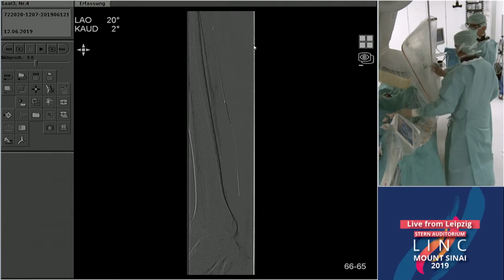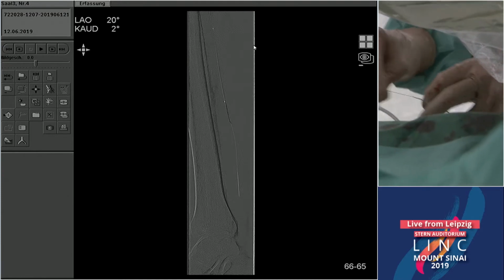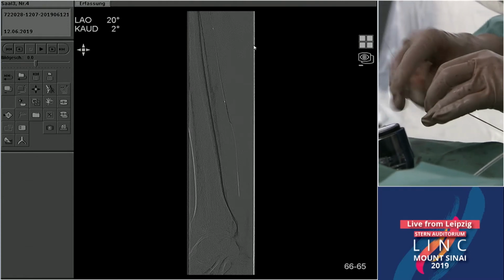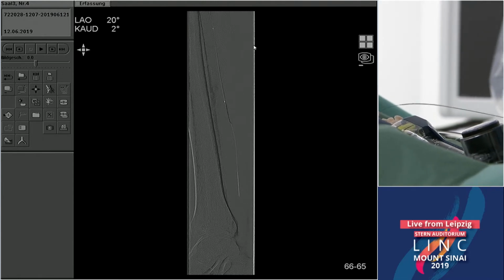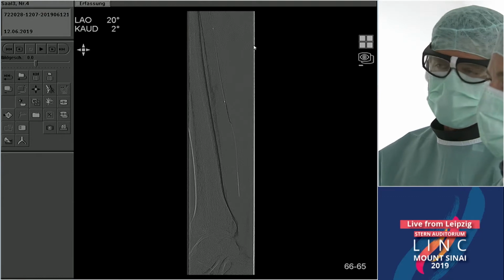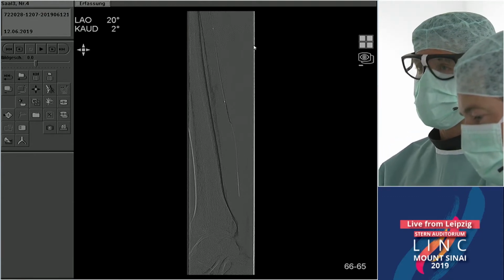Yeah. No, I think we'll find it back in here. I think the artery was open again. I mean, the problem here was just to find the entrance in the posterior. We'll not pull the wire out of the entrance now, but I pulled it completely out of that spasm area. And we just have to wait now, I think. But again, it can really take quite some time.